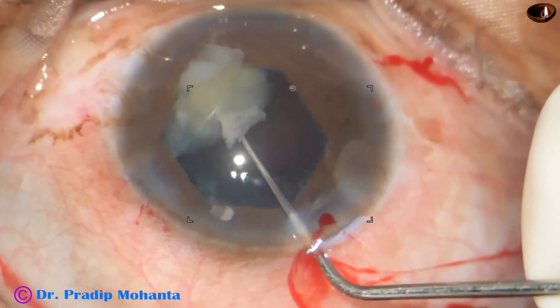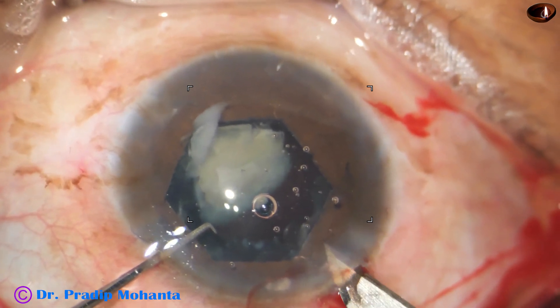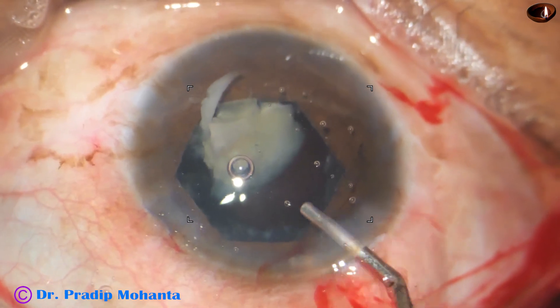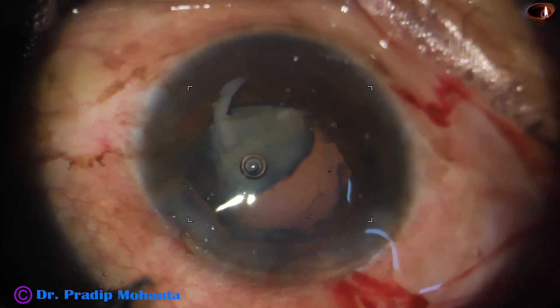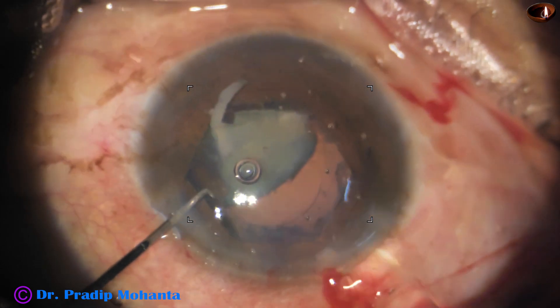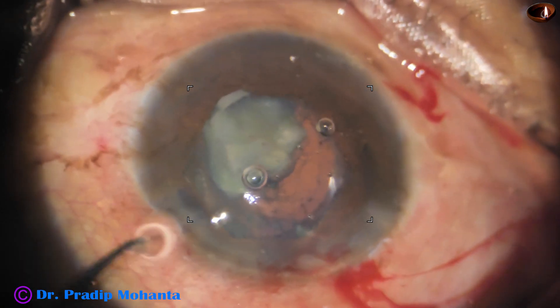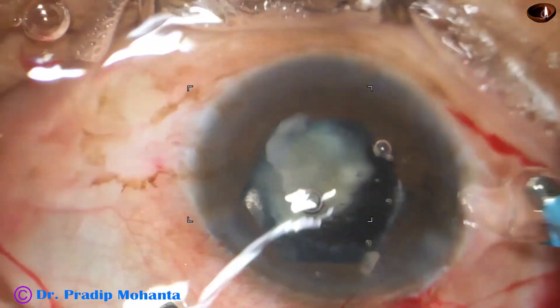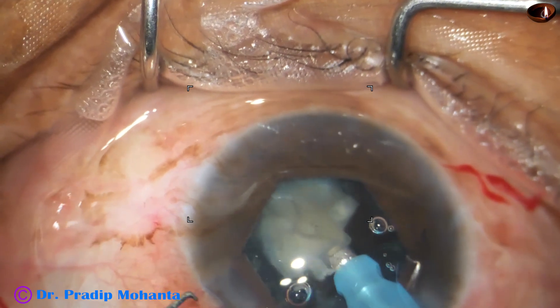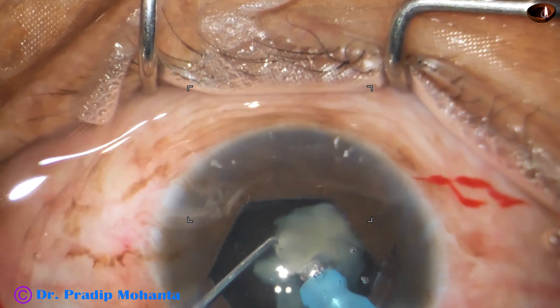I tilt the nucleus, get a space to introduce the lens, and enlarge the incision a little bit. I inject some visco — this is the stereo coaxial illumination of the Lumera T microscope — and here goes the intraocular lens. The trailing haptic has gone into the capsular bag. Now, over the lens, we can safely emulsify the last piece. Ultrasonic energy is about 65%, flow rate is 45 ml per minute, and vacuum is 450 mm of mercury.